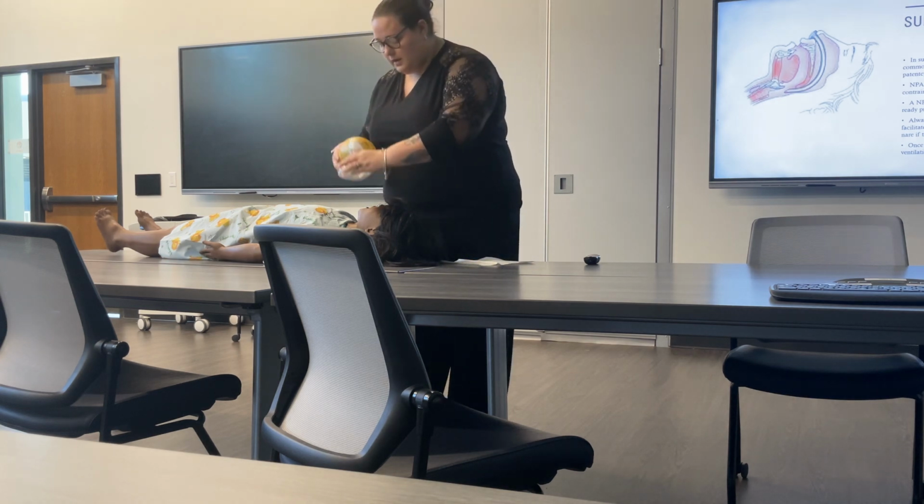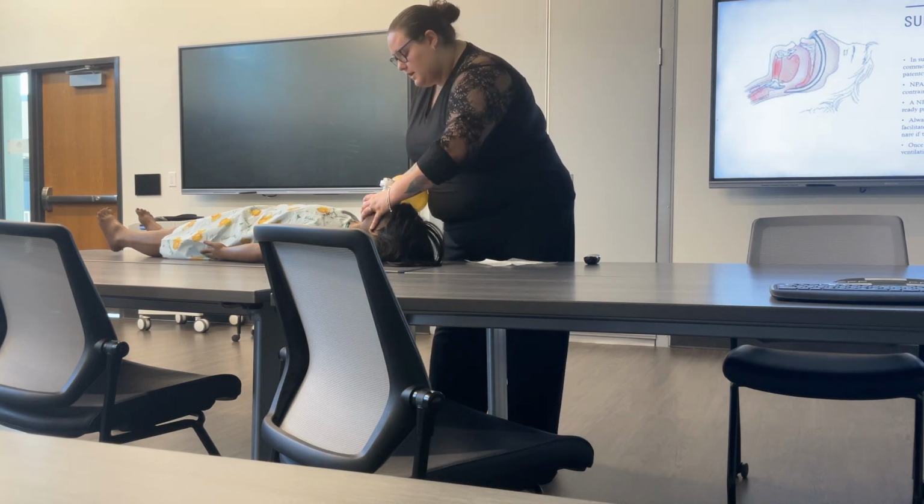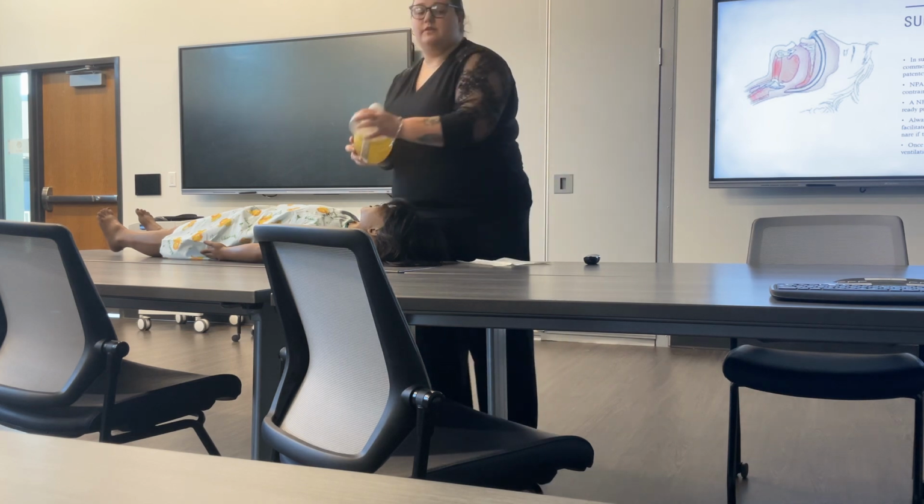And then you have your BVM here using my CE method. Your C here with your E opening the airway and giving just enough breath to ensure chest rise and fall. And then you facilitated an NPA.